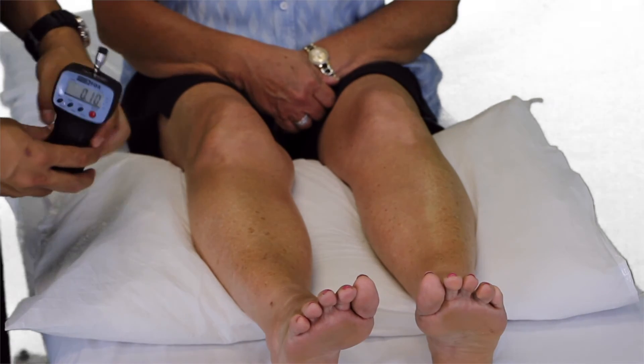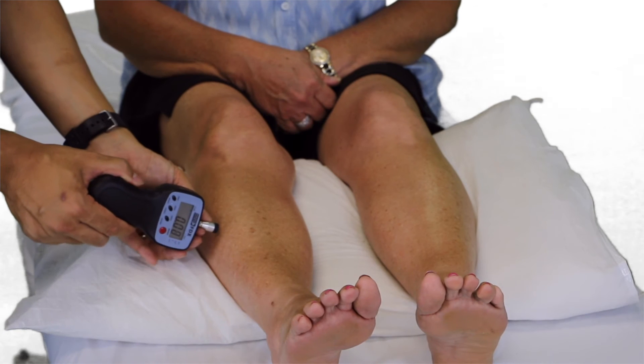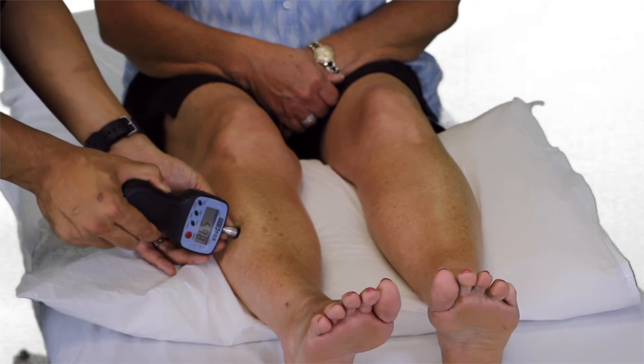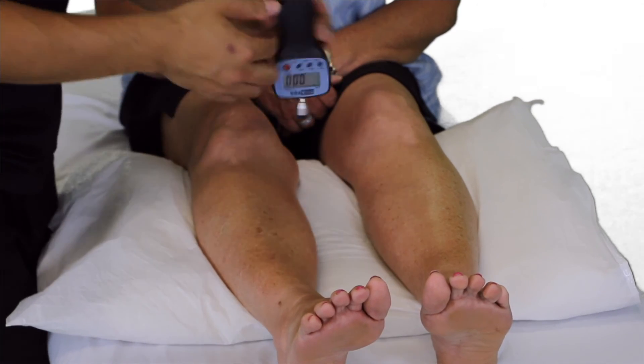You can also look at sites distal to the pain. Here we can use the tibialis anterior. Let me know when pressure becomes pain. We will do that three times there, and we can compare to the opposite side.